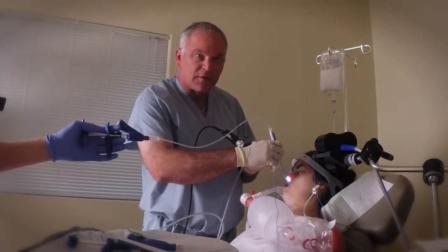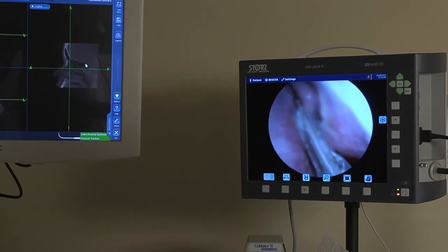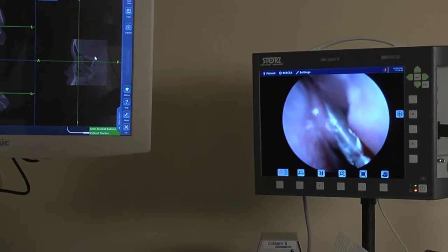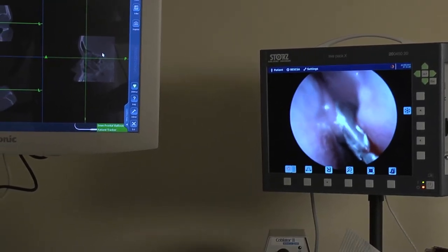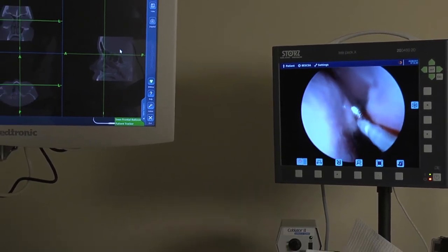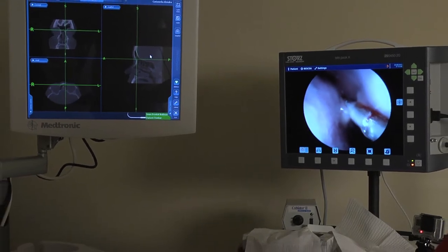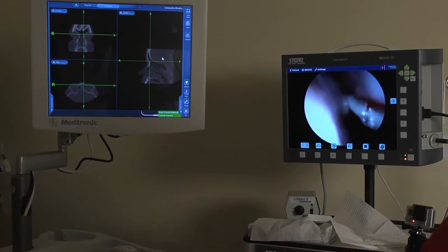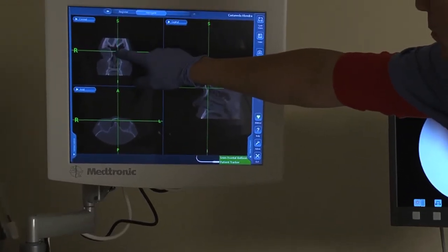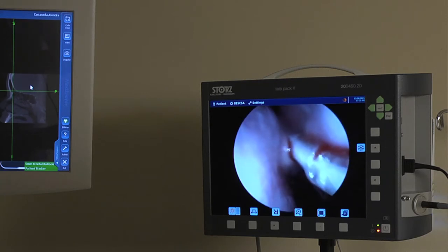The first thing we're going to do is go into the frontal sinus. This is the balloon entering the left nasal cavity. That's the middle turbinate. And then I'm working the balloon. If you watch on the computer screen, you can see that the balloon is already up into her frontal sinus — those X's in the upper left. So the balloon's in the proper position. And now we're going to inflate the balloon.